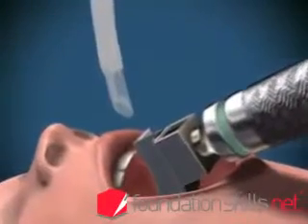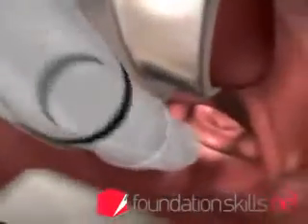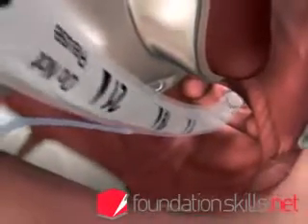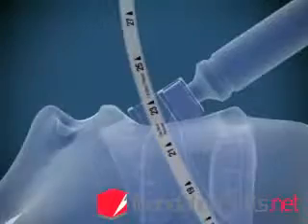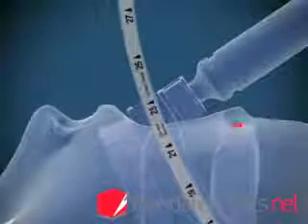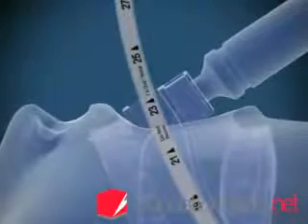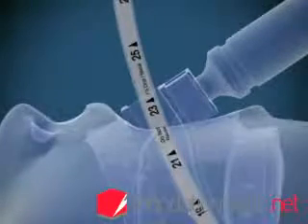With the right hand, insert the endotracheal tube from the right-hand side of the mouth directly between the cords and into the trachea until the cuff passes through the cords. The markings on the tube at the incisors will show between 21 and 24 centimeters in the average-sized adult when the tube is in position.